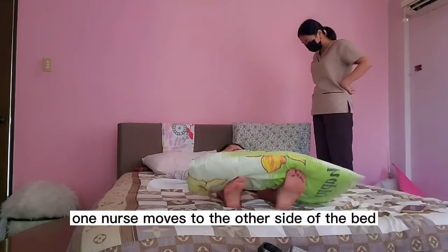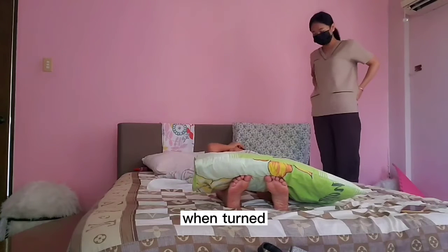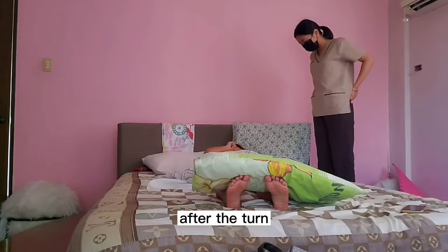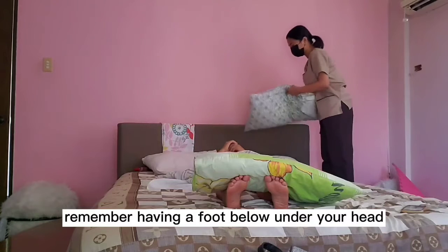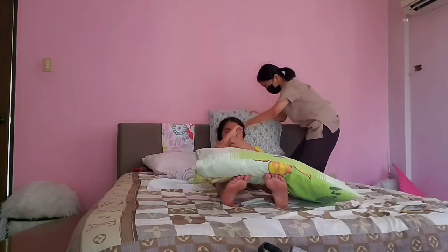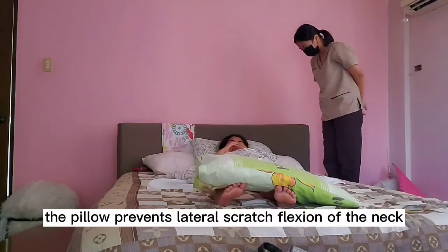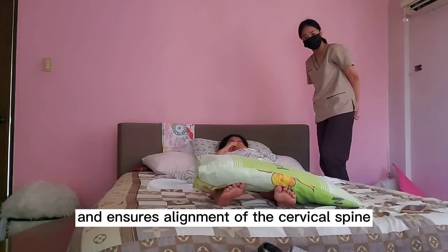One nurse moves to the other side of the bed and places supporting devices for the client when turned. So place a pillow where it supports the client's head after the turn. Okay, ma'am, I will now put a pillow under your head. The pillow prevents lateral flexion of the neck and ensures alignment of the cervical spine.